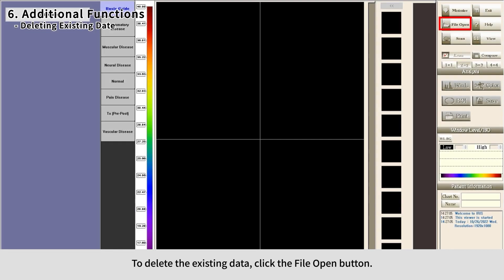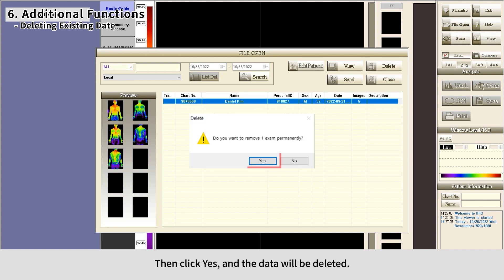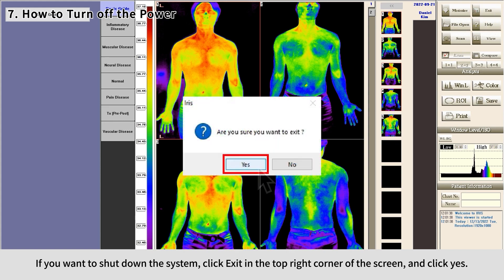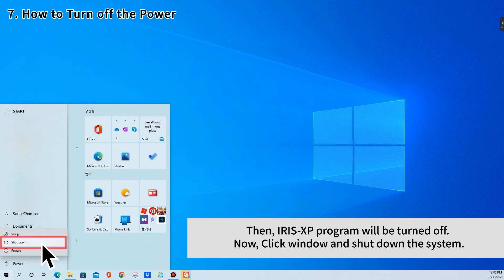To delete existing data, click File Open, then select the category and click Search. Select the data you want to delete and click Delete, then click Yes to confirm deletion. To shut down the system, click Exit in the top right corner of the screen and click Yes — the Iris XP program will turn off. Then click Windows and shut down the system.